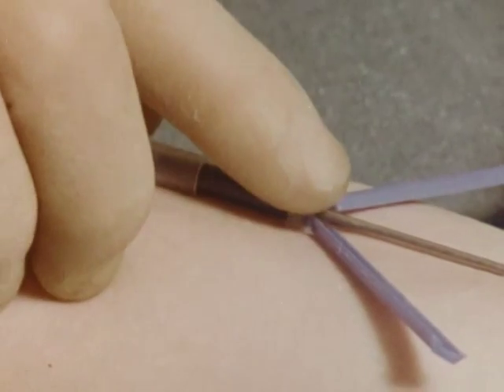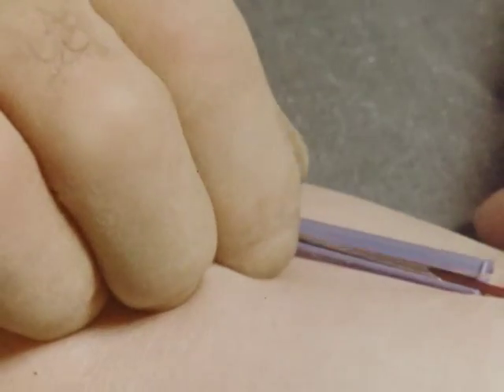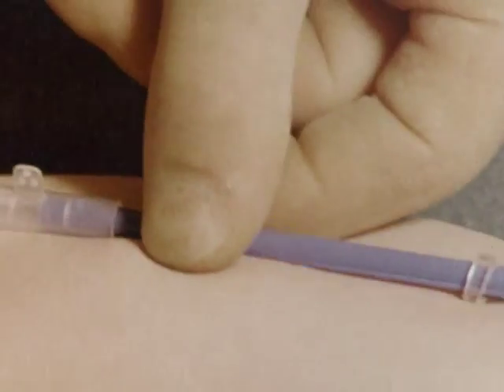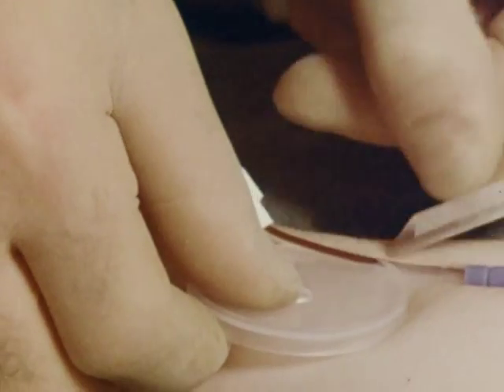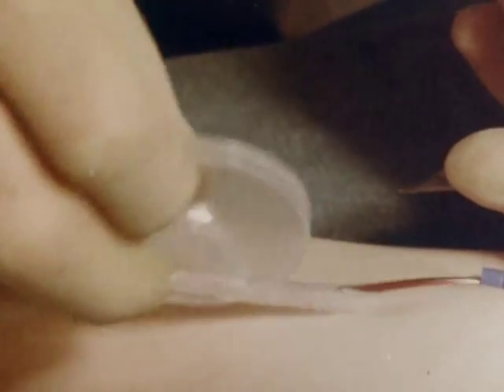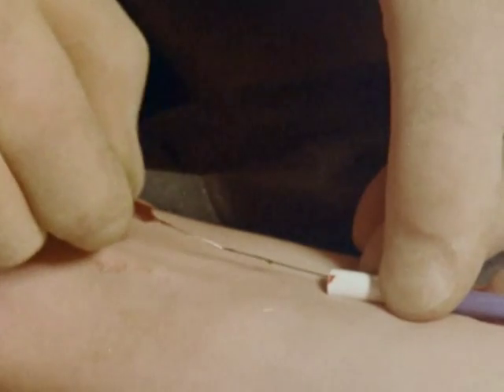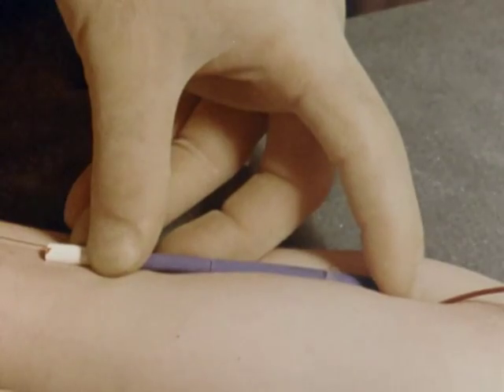Insertion of this type of catheter is not without its dangers, and if obstruction is felt, the unit should be withdrawn and the procedure restarted. Once in position, the needle must be immobilized and the retaining ring should be fastened into place and strapping applied to the needle guard. The stilet can then be removed, and the catheter connected to a drip set with an extension tube for monitoring the pressure readings.